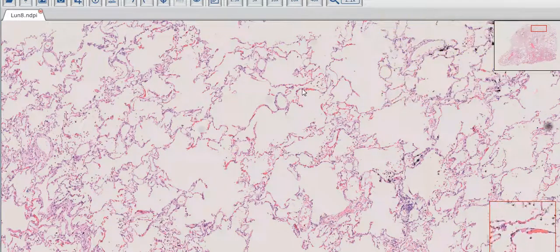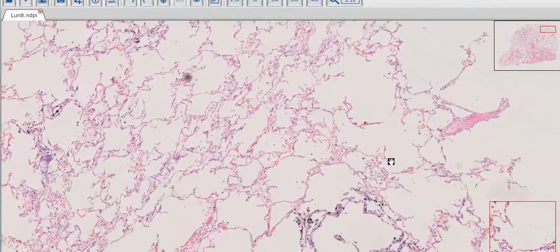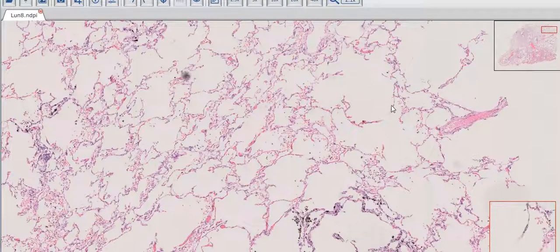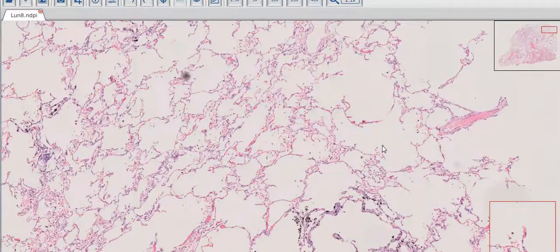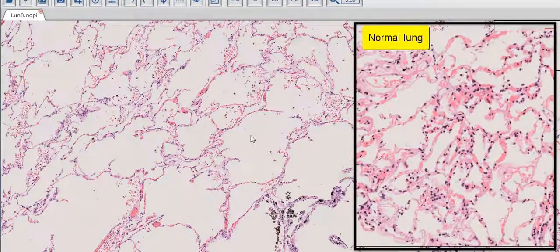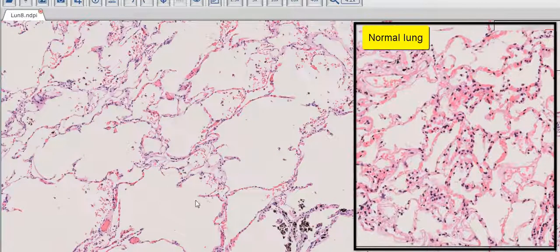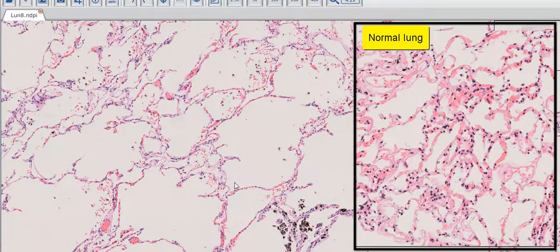Microscopically, we will see that these airspaces are indeed dilated. As I move around, you can see that they are larger. In fact, many of the walls or the septae of the alveolar spaces look like they are floating around and this is a characteristic appearance in emphysema.